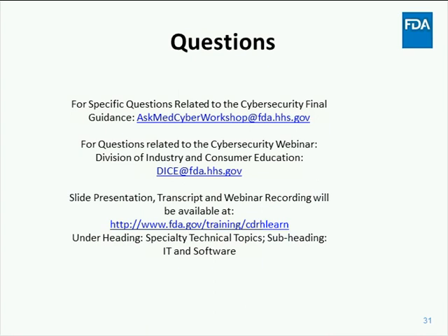I don't think I understood the end of the question, but I do think I understand the intent here, so please correct me if I'm wrong. Reporting to the ISAO does not absolve the manufacturer from giving that information in customer notification. So it's not that the public or the customers won't know about the issue. It's not that it will go to the ISAO only. It's going to your customers. The intent of not enforcing the reporting requirement to FDA under 806 is to facilitate the expediency of the fix. Your customers know, and with that customer notification or field correction action letter, you can focus on the fix as opposed to reporting to the FDA. Does that answer your question?